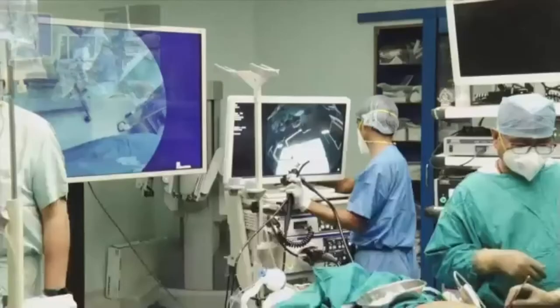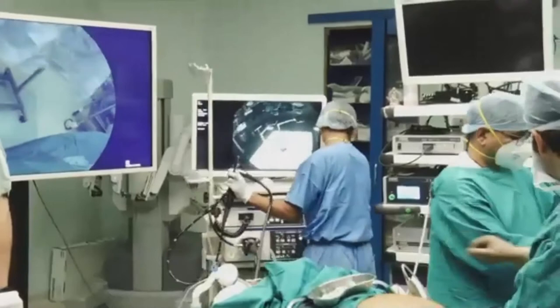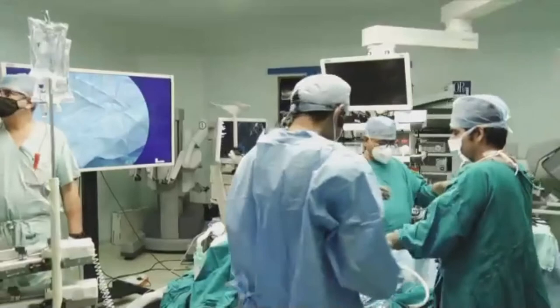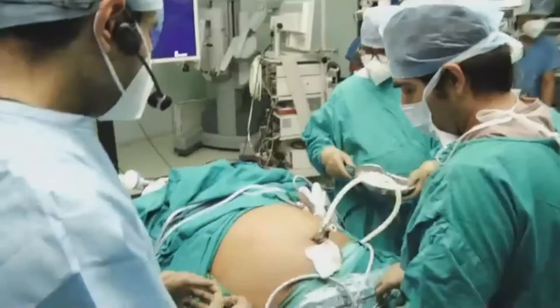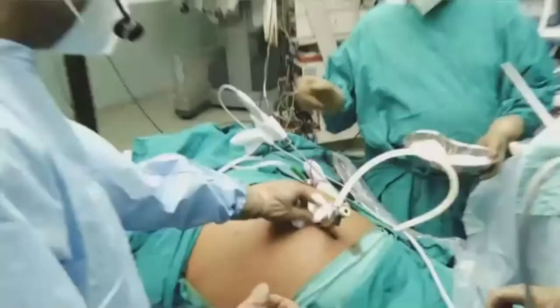Now I am going to put ports in this patient to perform the mini bypass. So we're going to perform a one anastomosis here. Let me show you the condition of the bowel. So just focus on the abdomen for now in the PIP, and then we'll have the endoscopic view which can go inside the main screen.